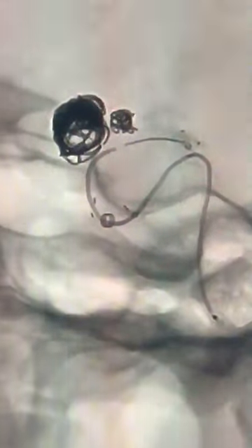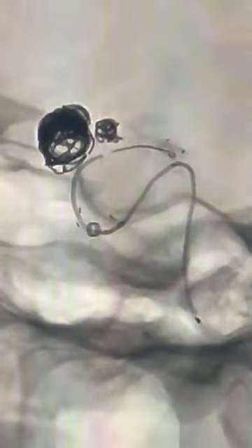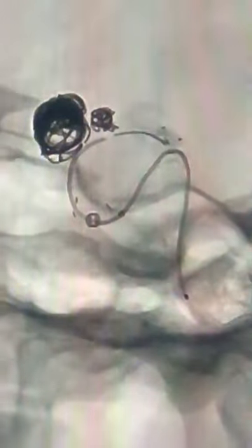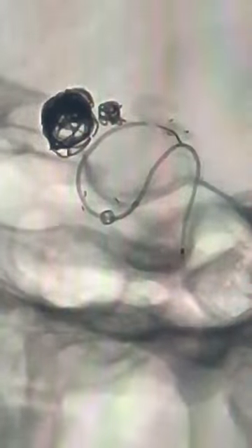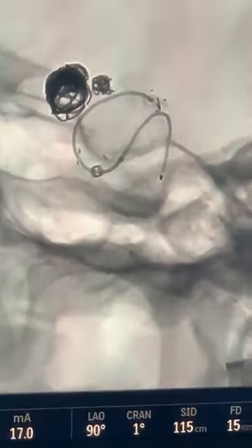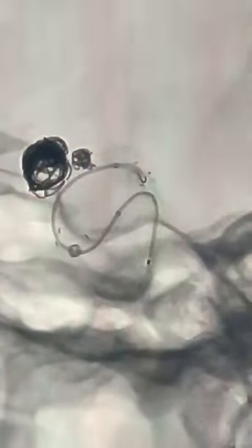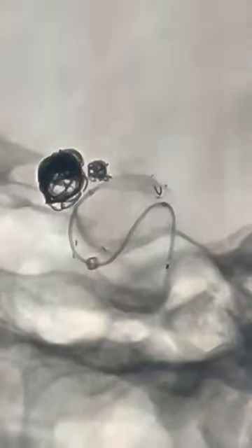Yeah, that's okay. All right. Hold it, now hold it. So we go a little more distal now. Yeah. Happy? Yes. This is a better position. That's a better opening.